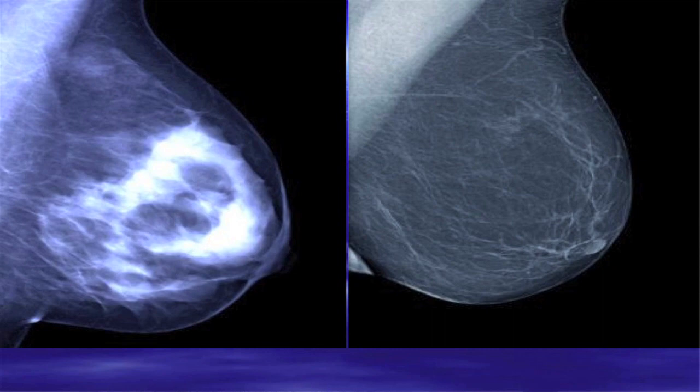It's in a background of a sea of fat. Here, if you put a 5 millimeter nodule, snowball's chance in hell of seeing that. On this view, you might see it on the CC view. You might not, because the same amount of breast tissue is going to be seen from the other direction. But you're hoping that by using two different views, you have your best chance of finding something in the breast.